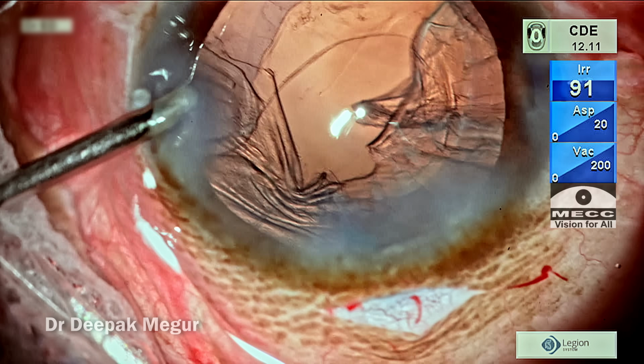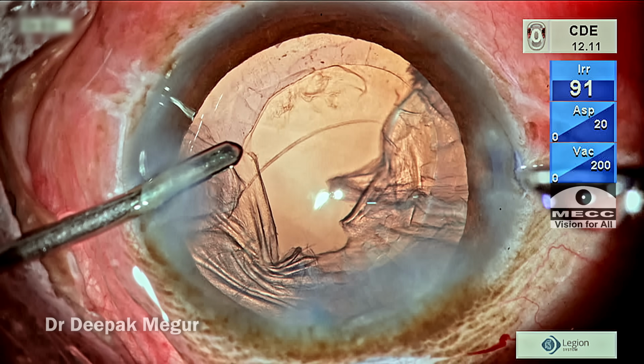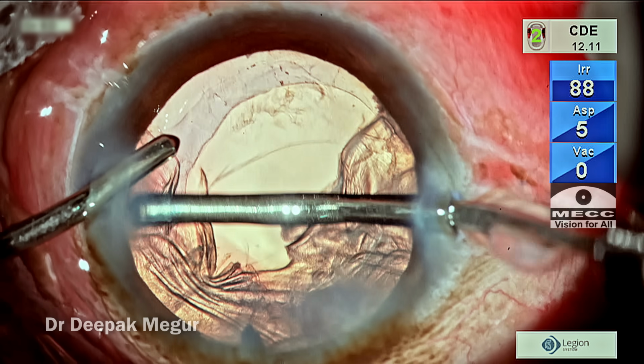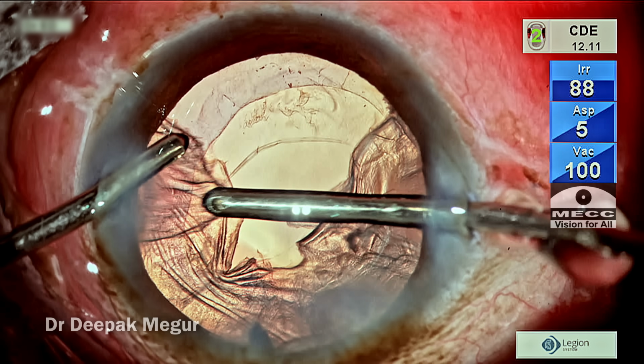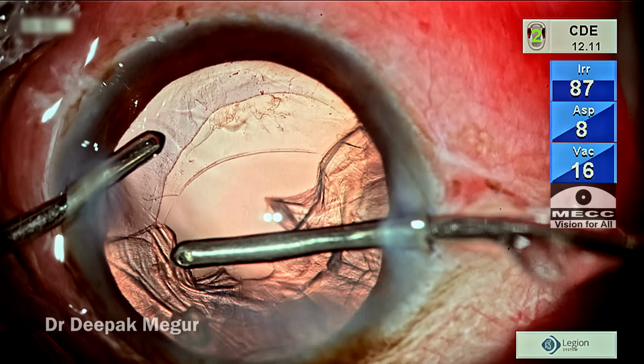Now, once I'm sure that there's no vitreous in the vicinity of the capsular bag, now is the time to deal with the cortex. So the first lesson: when vitreous prolapse is there, stop everything, deal with the vitreous, and then proceed to remove the cortex.